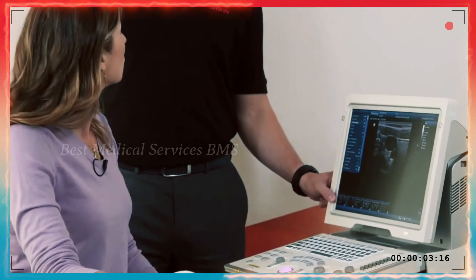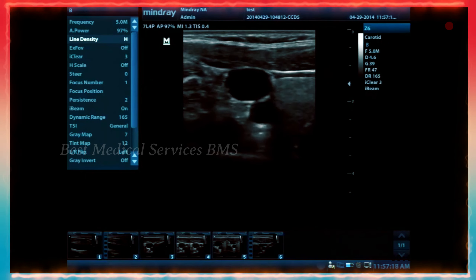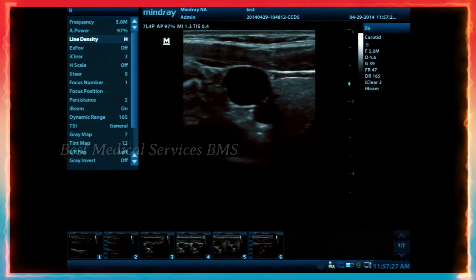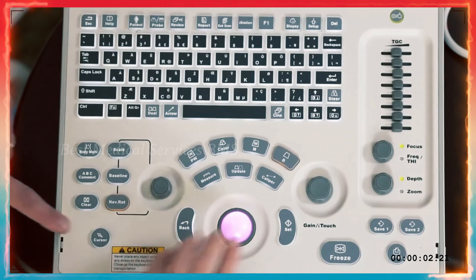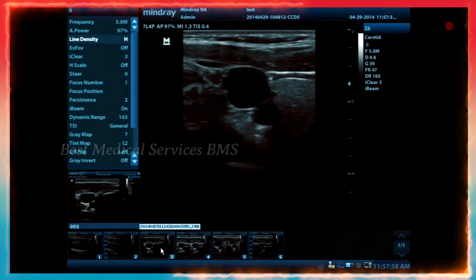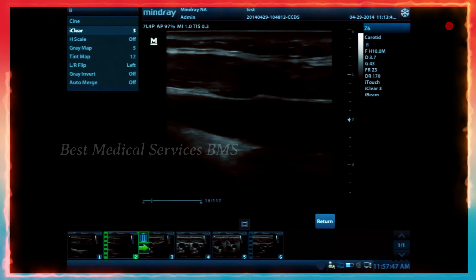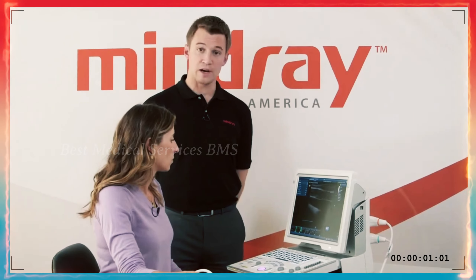Looking at the saved images and clips along the bottom as thumbnails — clips will have a little movie strip reel icon. If you press the cursor button and hover over a thumbnail, it makes it a little bigger. Double press the set button to make it larger to see that image. Double press the set button on a cine clip and it'll run through all the frames. You can then use the trackball to scroll back and forth through the frames and even save a still image from there by pressing save one.